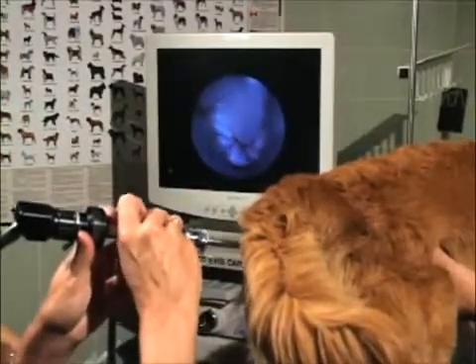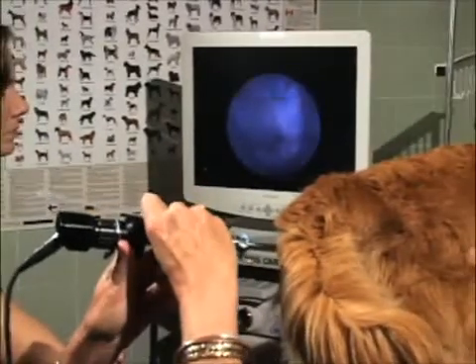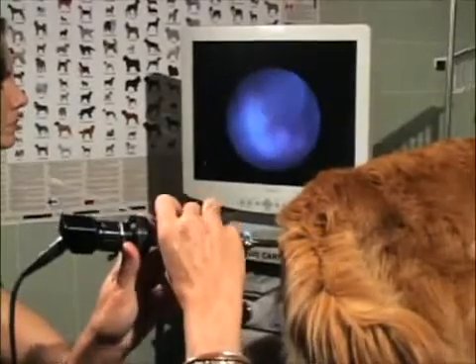The canine cervix in estrus has a rosette appearance. The cervical os is located at the center of the rosette, usually appearing ventral.